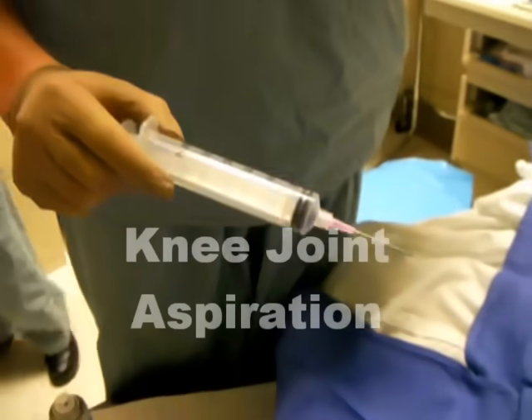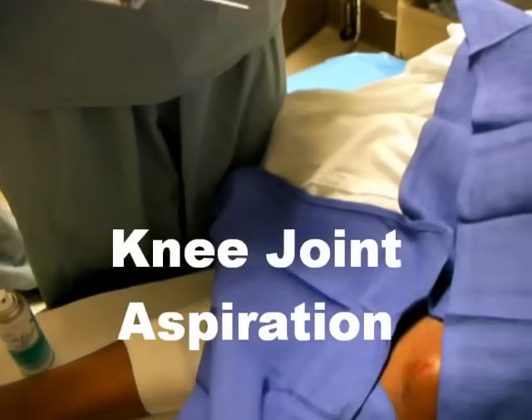This procedure will be doing aspiration of the left knee. The indication for this is that the patient has a prior GSW approximately a year ago, and has a warm knee that has limited range of motion at this time.